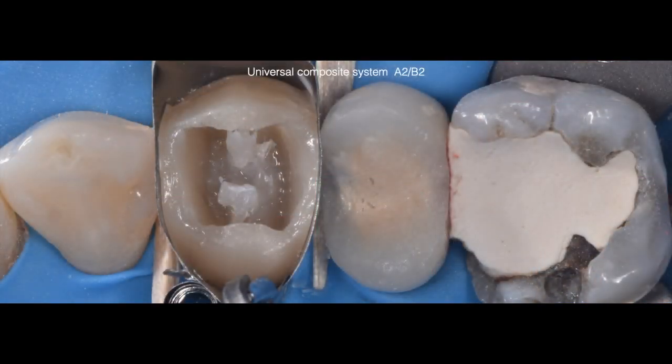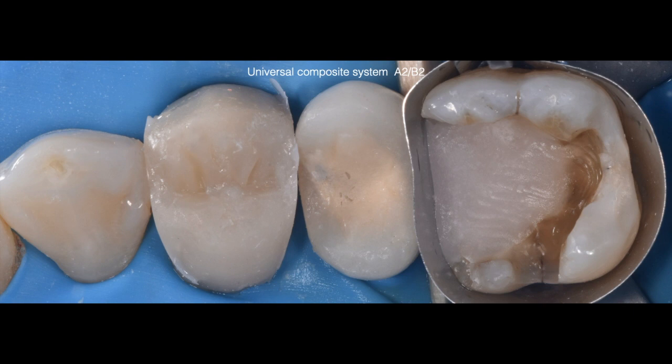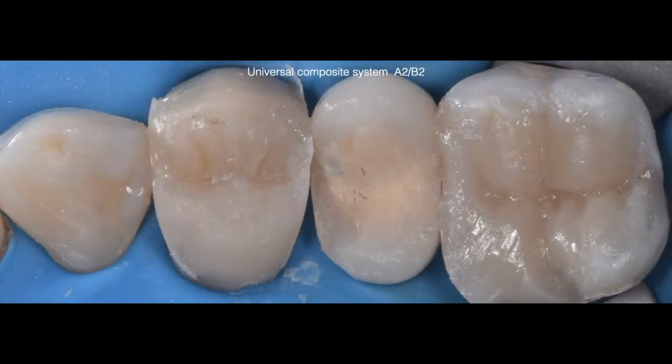Out of this wax-up, we created buccal and lingual matrices to help us achieve ideal dental anatomy of these walls. Here you can see both buccal and lingual walls completed, followed by the placement of a matrix band and wedges to restore the proximal walls. Once completed tooth number 12, we initiated restoration of tooth number 14. The first step was to elevate the margin using resin-modified glass ionomer, followed by adding Brilliant EverGlow A2B2 until all contours were restored.